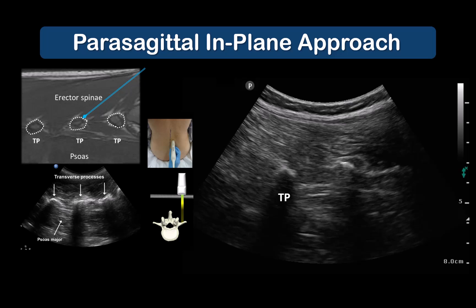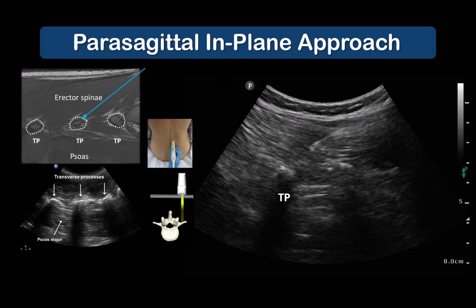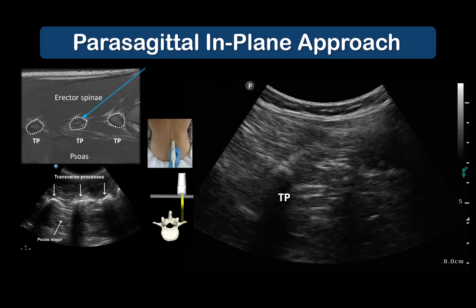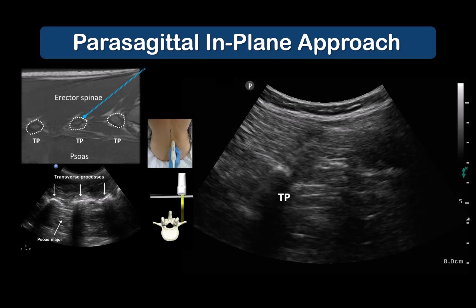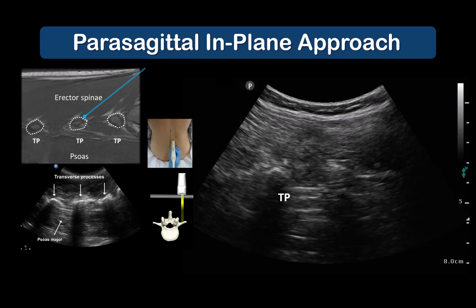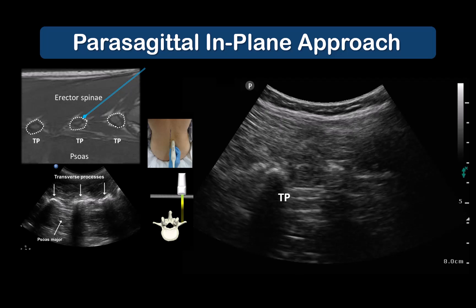The parasagittal in-plane approach is the one recommended as it's simpler and easier to learn. The finger-like projecting shadows of the transverse processes are visualized deep to the erector spinae muscle. An 80 to 100 millimeter needle is inserted to contact the target transverse process. The endpoint for local anesthetic injection is fluid spread superficial to the fascia that separates the two muscles. This may appear somewhat intramuscular, but this is acceptable as long as spread is seen occurring in a cranial-caudal direction and generally lifting the muscle rather than just pooling within it.